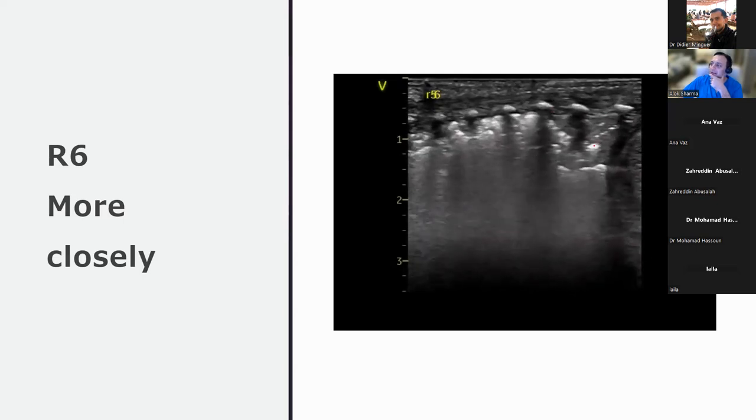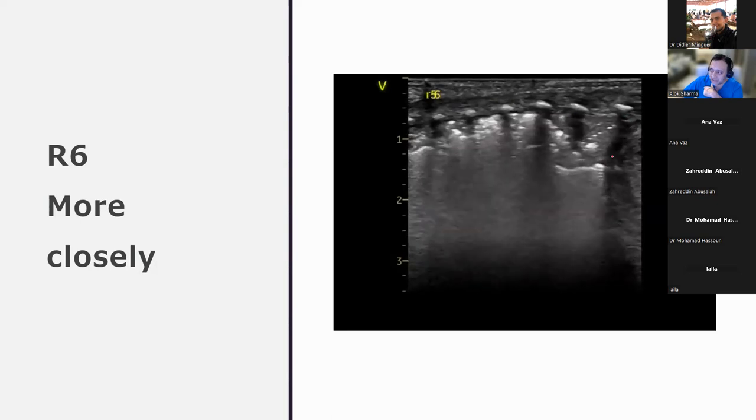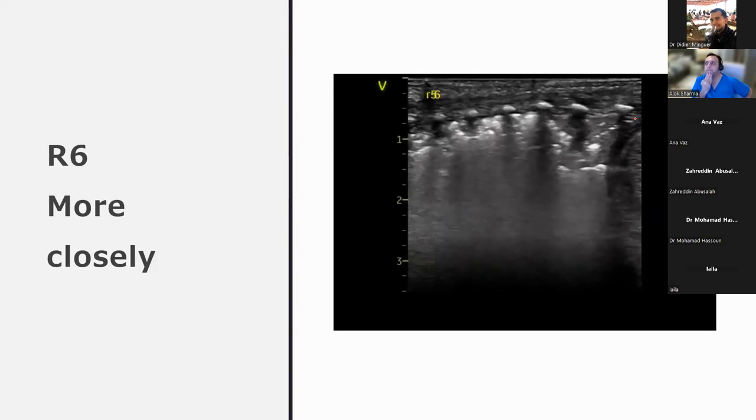Again, static air bronchograms, it's very hypoechoic. And actually, this area in particular is classical atelectasis for you because of fluid. Here, you've got subpleural consolidations, very irregular pleura. Now, the question is, this is compressive atelectasis due to fluid. And this is another point that I want to make: if you have compressive atelectasis secondary to fluid, do you think recruitment will make a difference? It might do, but it might not. And really, for compressive atelectasis with a massive pleural effusion, it's drainage of the fluid that becomes important, in addition to any ventilation changes that you want to make.